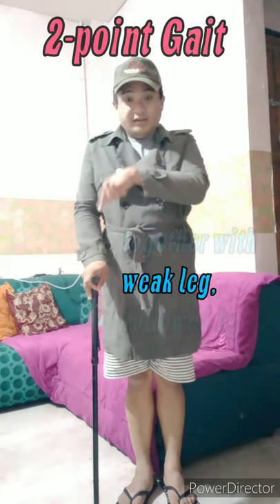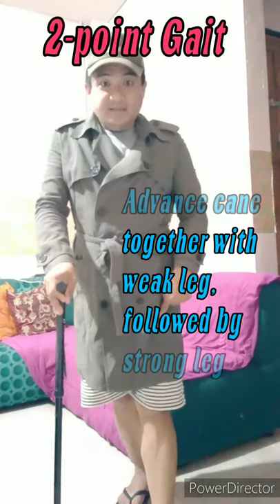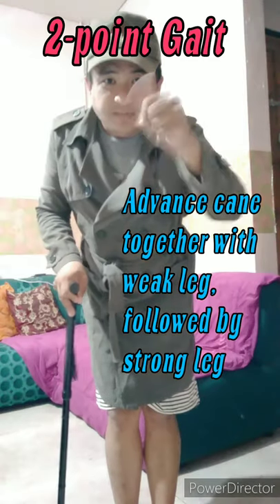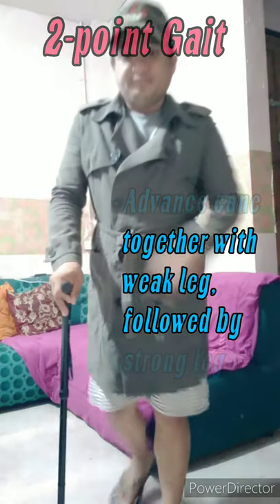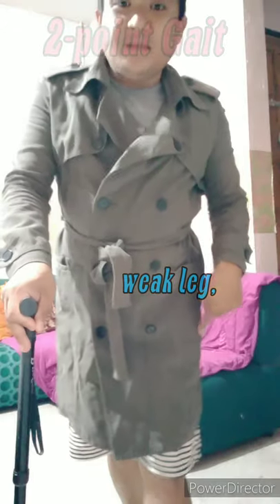We have different gait patterns. First, we have the two-point gait. For the two-point gait, you advance the cane together with your weak leg — that's one — followed by your unaffected or strong leg — that's two. So: advance the cane together with the weak leg, followed by the strong leg.